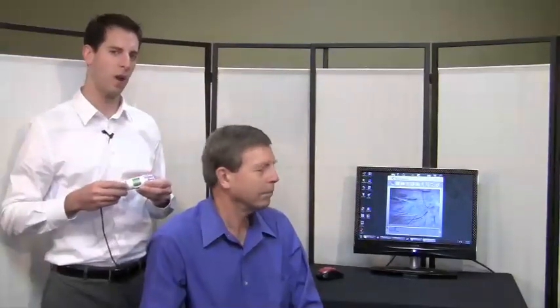And then we can compare that to the second image we captured of the more thin area. And you can do individual hair counts. To make this easier we have this CompareView Hair software which allows you to manually count those hairs and which does an average of those hairs on that image for that area of the scalp. Which makes it much easier to compare the images and the scalp density in different areas of the scalp.